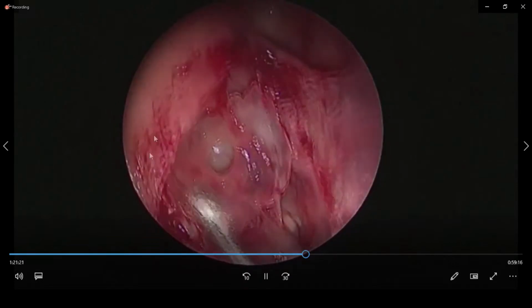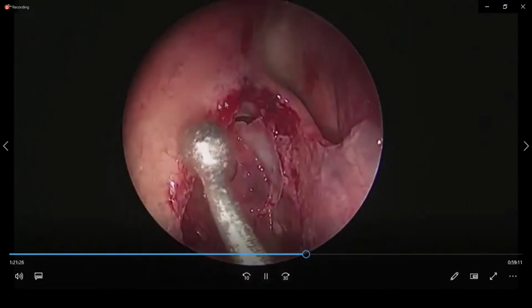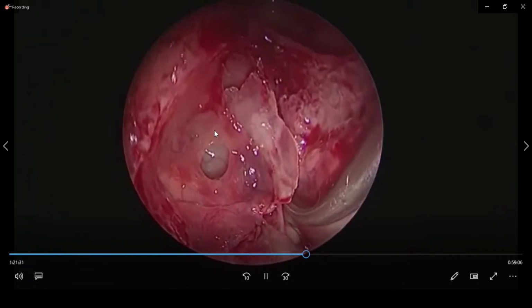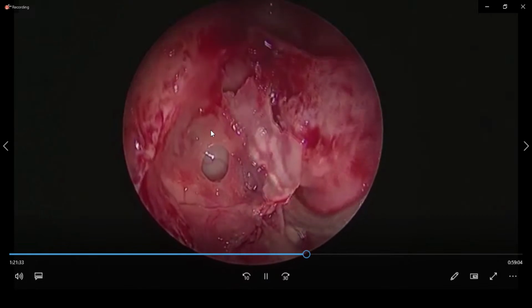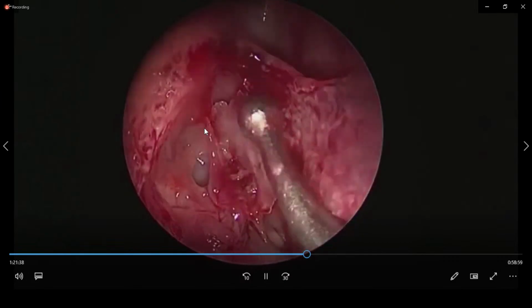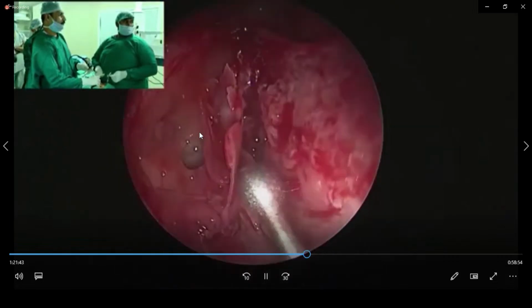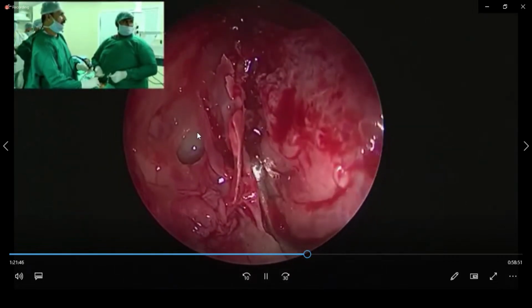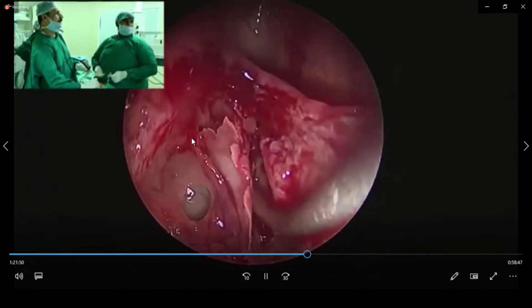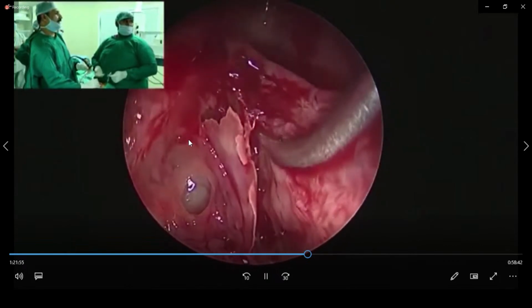All the limits: lateral limit, medial limit, posterior limit, this bulla, and this is your whole agger nasi. Now you go medial to the agger nasi and behind it. Can you see this through the bone? See the thin lamella of the agger nasi. You can go behind and superior to it and fracture it laterally and anteriorly. Go behind and fracture it anteriorly. See this? In order to get into the frontal recess.